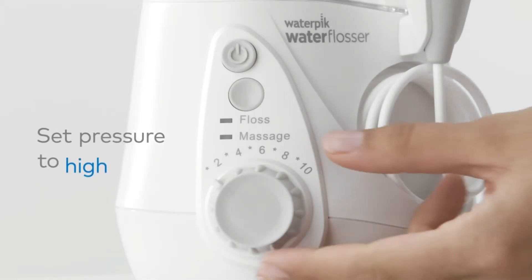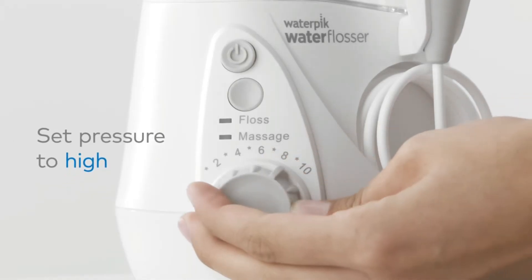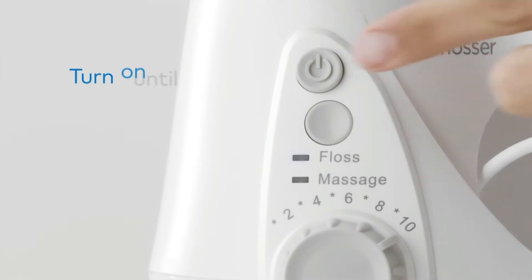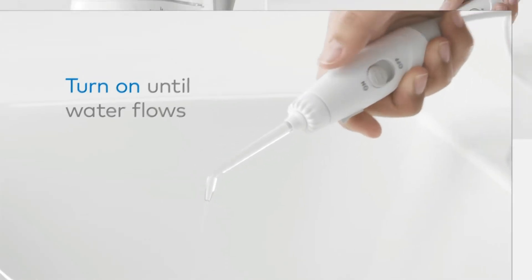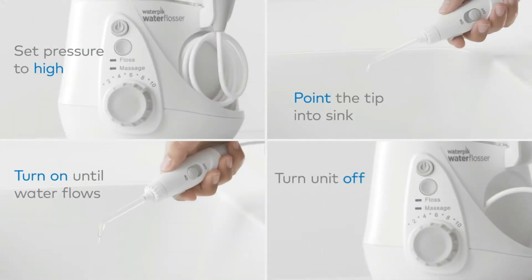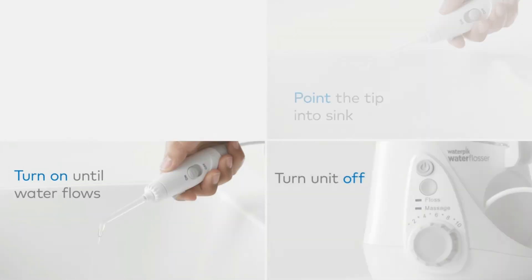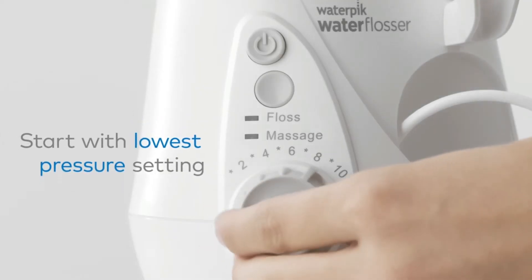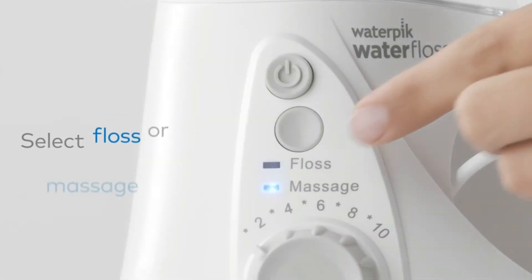There's even a separate mode that pulses water to massage your gums. It comes with seven tips that serve different purposes: three classic, one for plaque, one for braces, one for periodontal pockets, and one with a toothbrush head. As a bonus, it's available in a bunch of fun colors like deep purple and navy blue — since it's going to stay on your countertop, the more color options the better, we say.